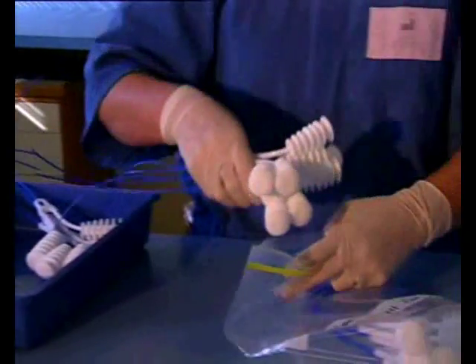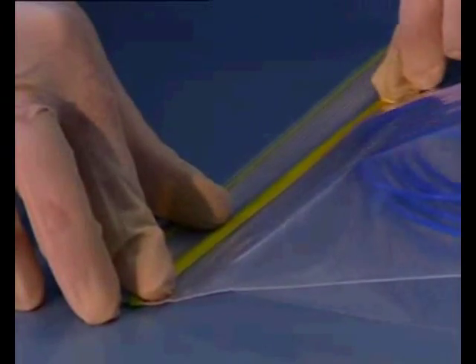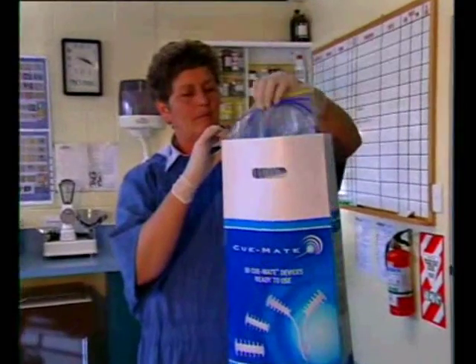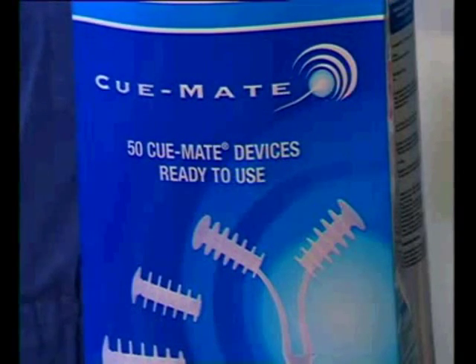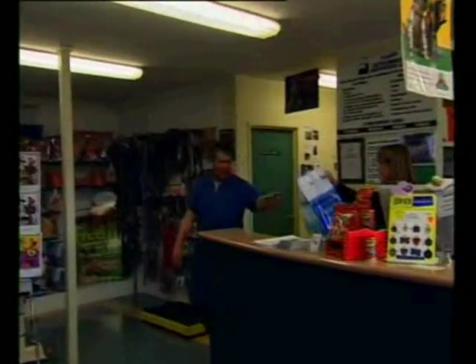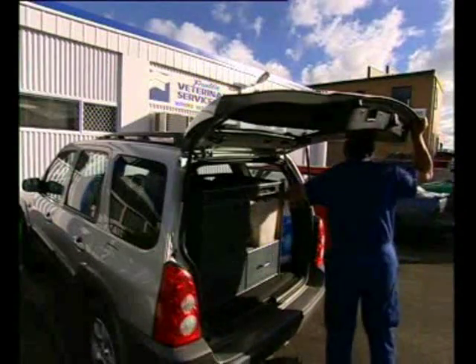Assemble the reloaded Q-mates and place into plastic bags. Seal the bags, double check the batch number and expiry date. The reloaded Q-mate devices are now ready for use. Q-mate is a cow friendly system for achieving improved herd reproductive performance.